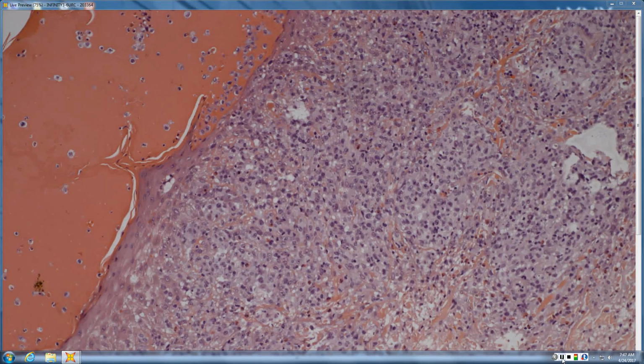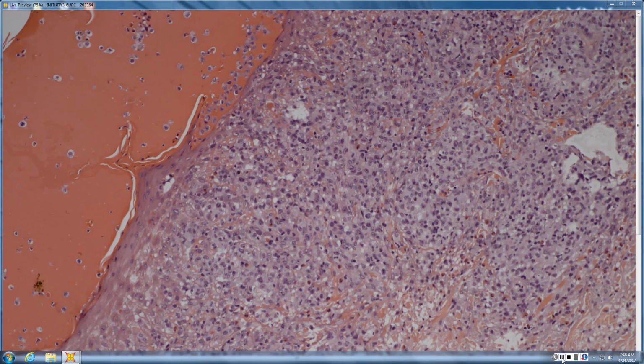If it's just LYP, you can safely ignore it. If it's large cell transformation, that's really bad and needs more aggressive therapy. So teasing those out is important. LYP, each little papule is going to self-heal. It's going to be small. It's going to be transient. It's going to heal. It's just you keep getting more. Tumor stage MF, CD30 positive, doesn't resolve. So clinical trumps everything else in that setting.